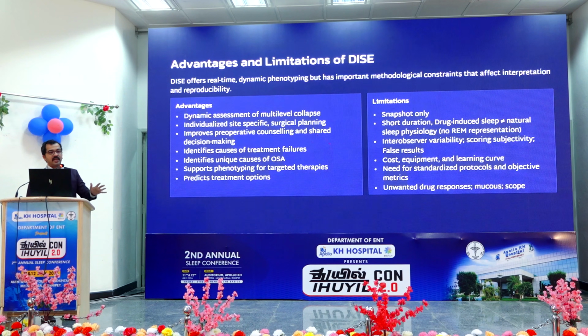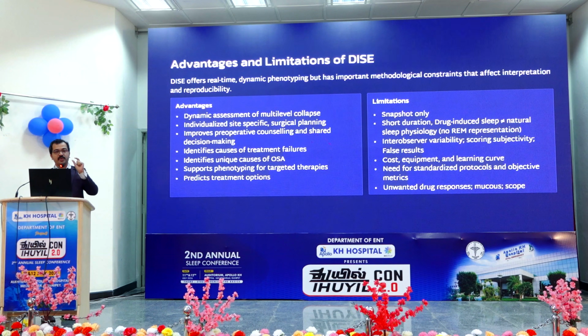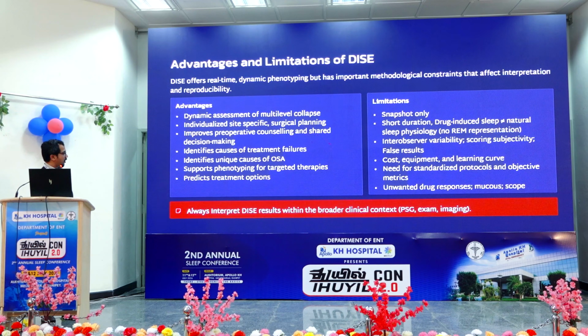Cost, equipment and learning curve. It needs all these equipments for doing a theatre, and you need a good theatre backup. There are less standardized protocols and objective measures of DISE, and unwanted drug response. All the drugs we are using for DISE have some unwanted response, either in the airway or in the neuro CNS actions. Another thing is the excess mucus in the oropharyngeal airway, and the size of the scope which occupies the nasal airway. So always interpret the DISE results correlating with your PSG and clinical examination findings.